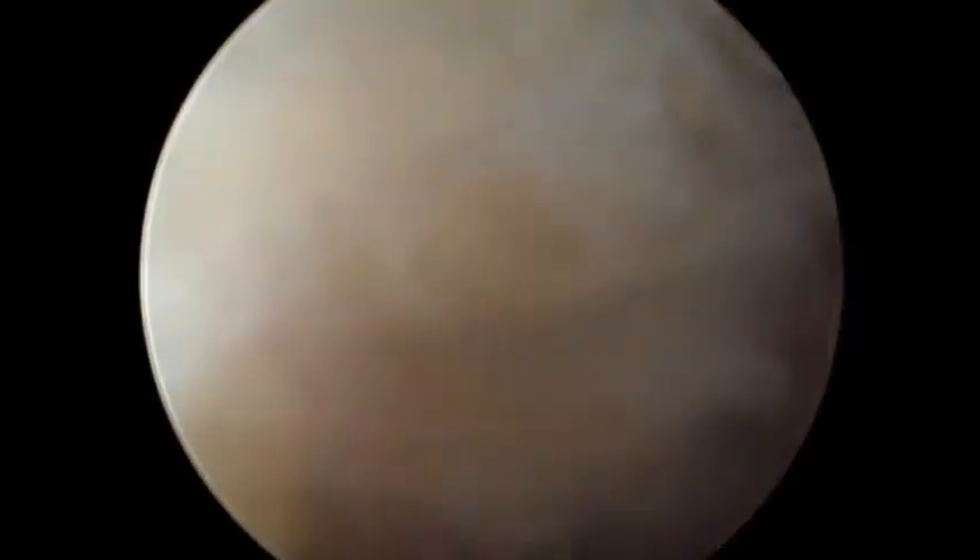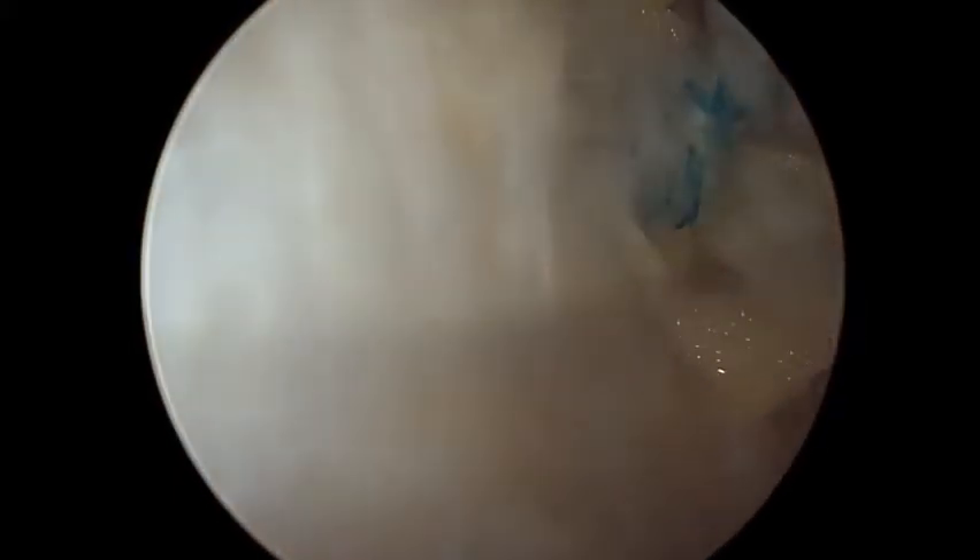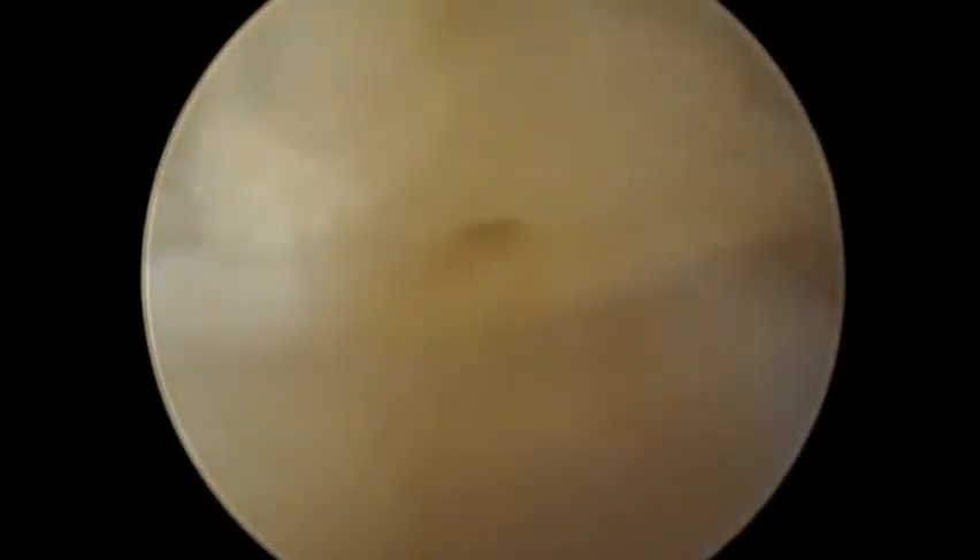The final result can be observed endoscopically and arthroscopically, with ligaments reattached and the retinaculum in a good position, just like in open surgery.